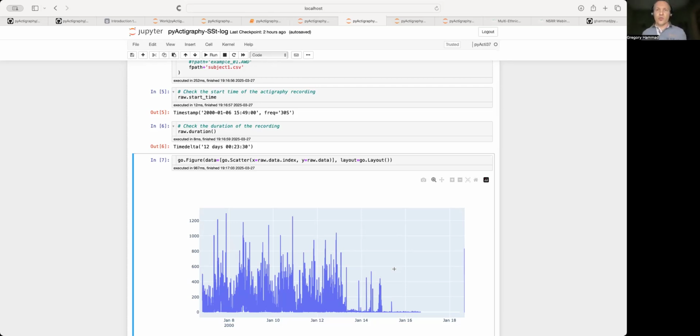Also, you ask them to return the device by post, and the recording might still be going on when you return it. Actually, in some of the recordings we had in our lab, we could see some early activity, and it was actually the postal handling of the device. And you could also see that people actually drive to the lab and return the device.